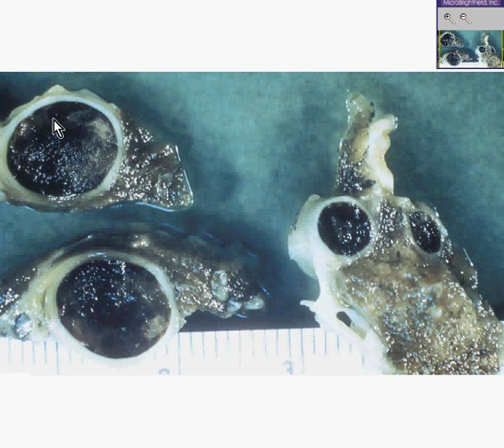It's not just the kind of red gelatinous blood you normally see post-mortem, but there are areas in it, perhaps, that look more fibrinous or whiter than usual. Here is the same thing microscopically now.